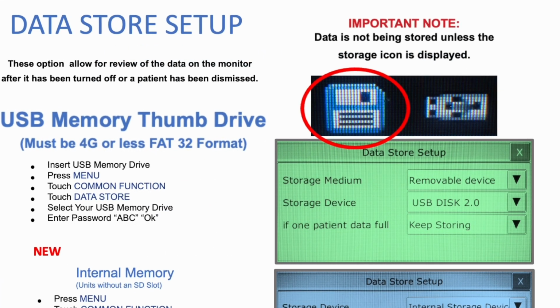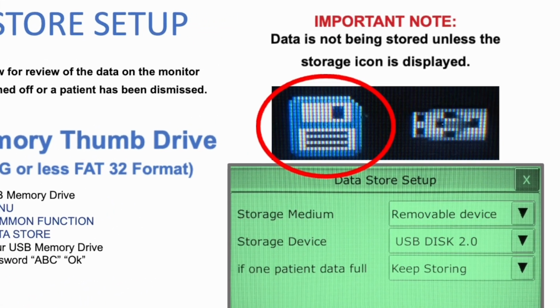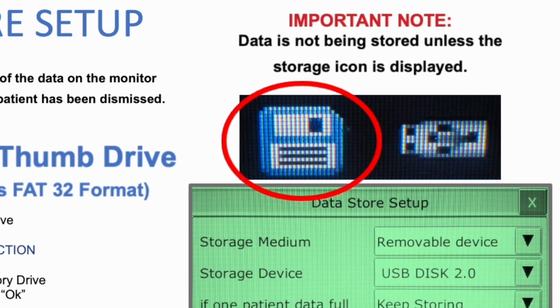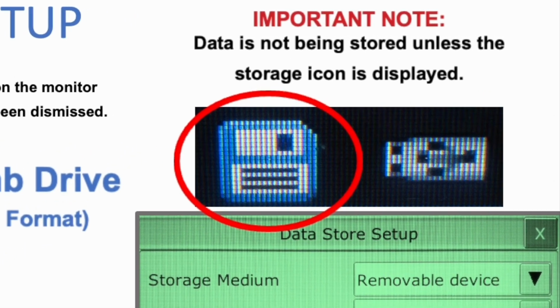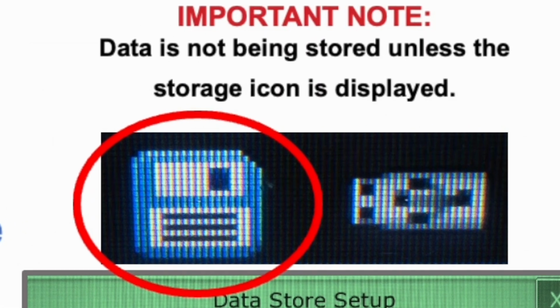It's important to note that data is not being stored unless the storage icon is being displayed. The information that is stored can be reviewed on the screen or printed. It is not designed to be transferred to a computer.